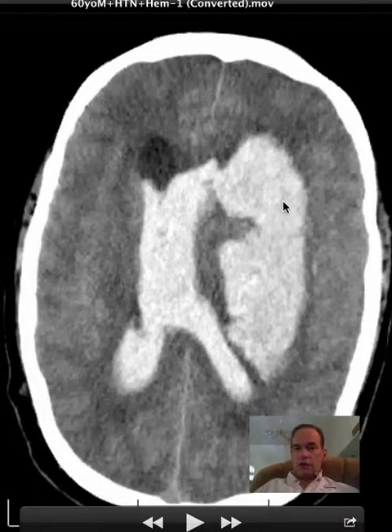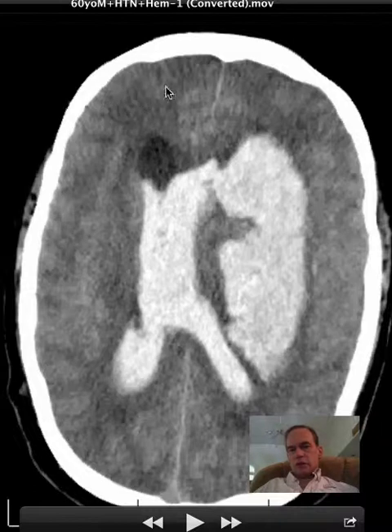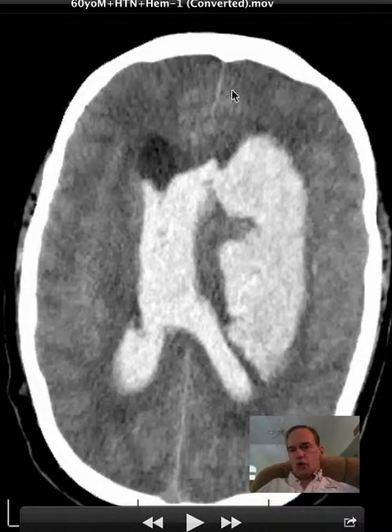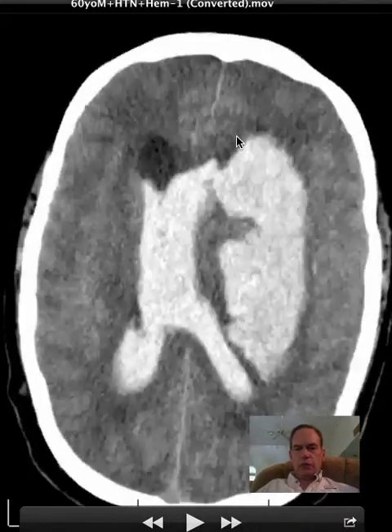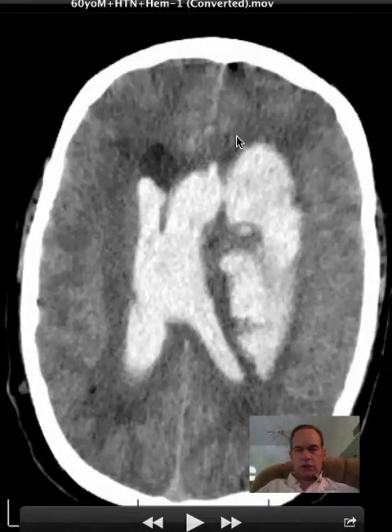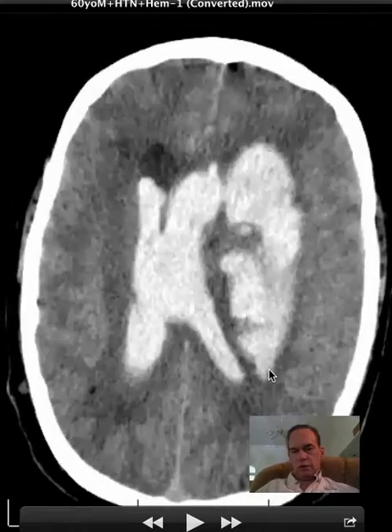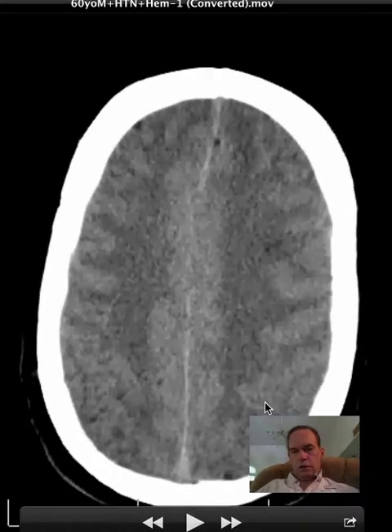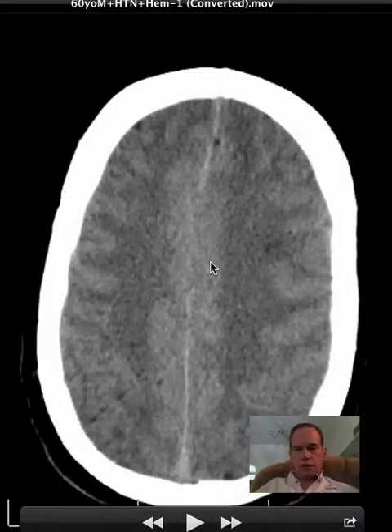This blood in the left hemisphere, which was hypertensive, extended into the lateral ventricles, causing increased pressure in them. That's also why this middle-aged to older person has no cortical sulci visible, because there's such a great deal of mass effect in both cerebral hemispheres. You can see a little bit of cortical sulci back here and maybe over here a little bit, and some from there too — here and here, and here and here. But elsewhere they're pretty tight.